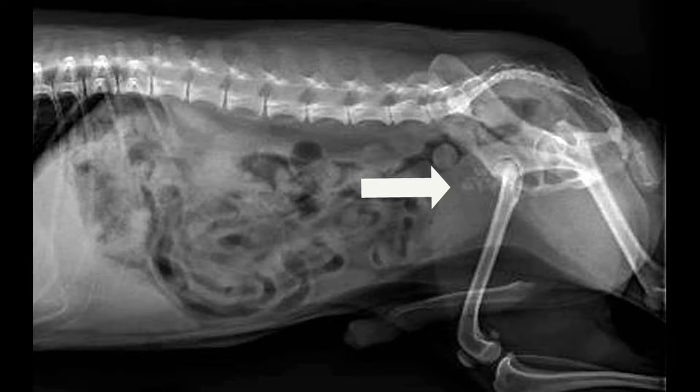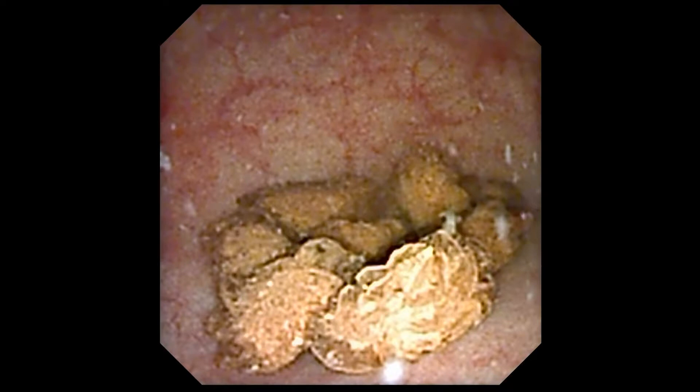Here's my dilemma. Clarence is small, and his urethral opening is narrow. He has lots of stones, and the diameter of my scope is 8.5 French. So I asked his primary veterinarian if he could pass an 8 French catheter easily beyond the os penis. I was given an affirmative answer of yes. But when I started the procedure, passing the scope was difficult. I didn't want to give up on Clarence or his owner. I knew that passing the scope multiple times could cause the urethra to swell, making it difficult for us to get in.